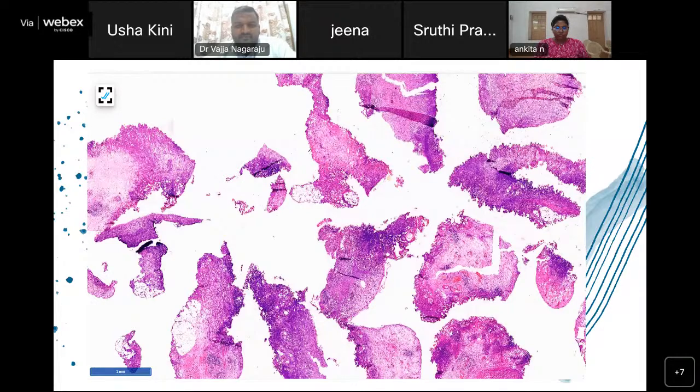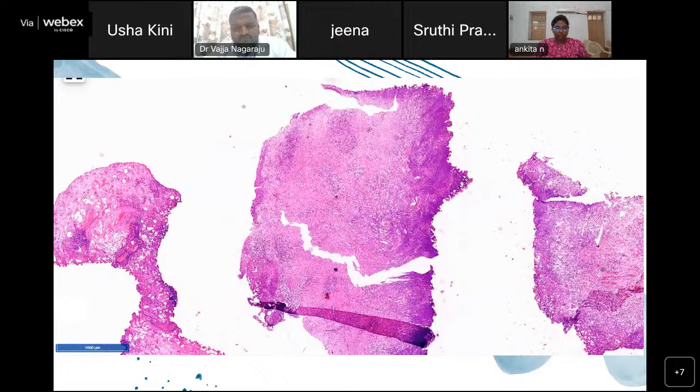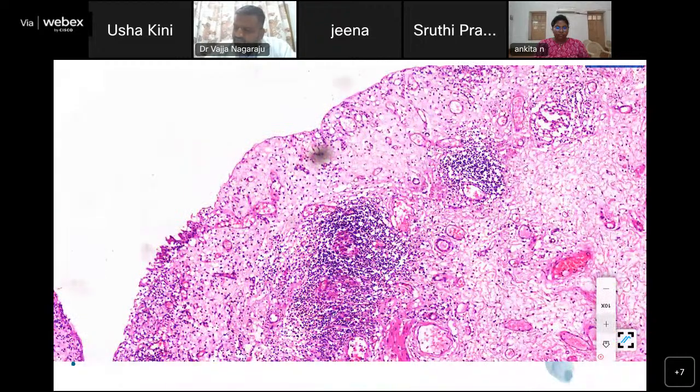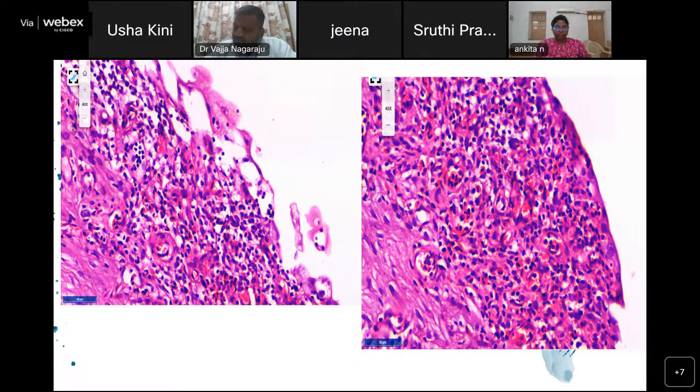tissue artifacts as well. And in one tissue, there was some preserved urothelium, and on higher power, it was showing hyperplastic urothelial cells and had dense inflammatory infiltrates. And there were some areas showing preserved urothelium, but it was thinned out. And on higher power, it was showing some atypia. But because of the inflammation, it's most likely to be a reactive change.